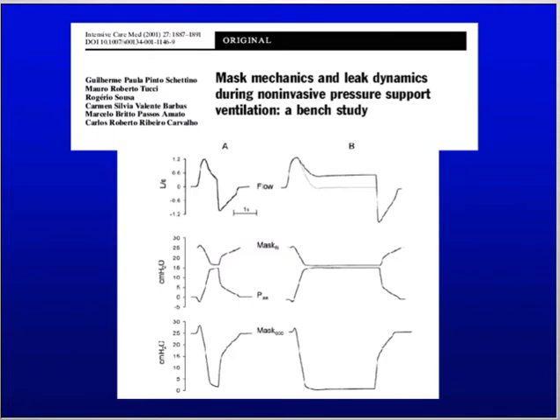When the pressure in the cuff remained higher than the pressure delivered by the ventilator, there was no leak. And you see here the delta between these two pressures, which never goes below zero. So in this situation, pressure support was delivered adequately with no leaks.